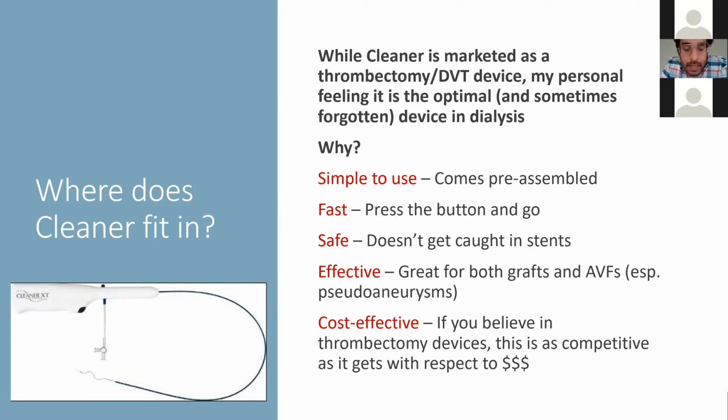But then the next question is why? And I think the reason is because you're macerating the thrombus, you're lacing it with TPA, and so because you're kind of whipping it up and also impregnating it with TPA, it probably just lyses on its own, and it probably resolves. So I haven't seen that issue with any type of declotting method, and that includes using Cleaner.